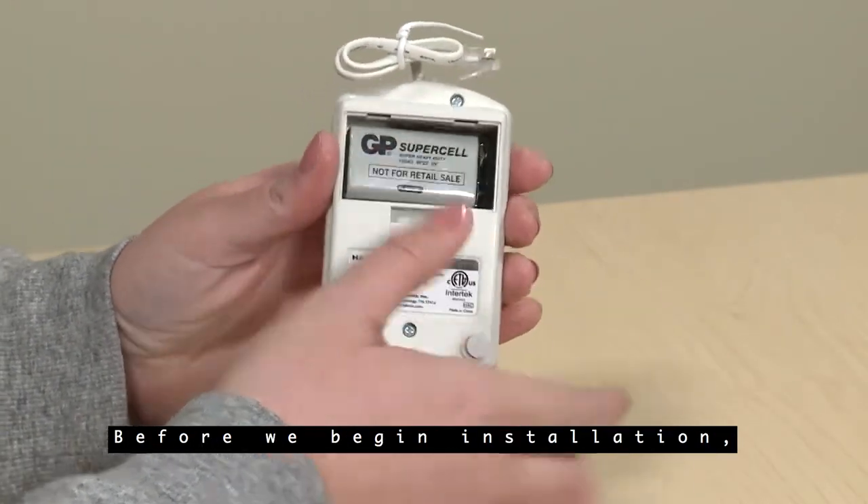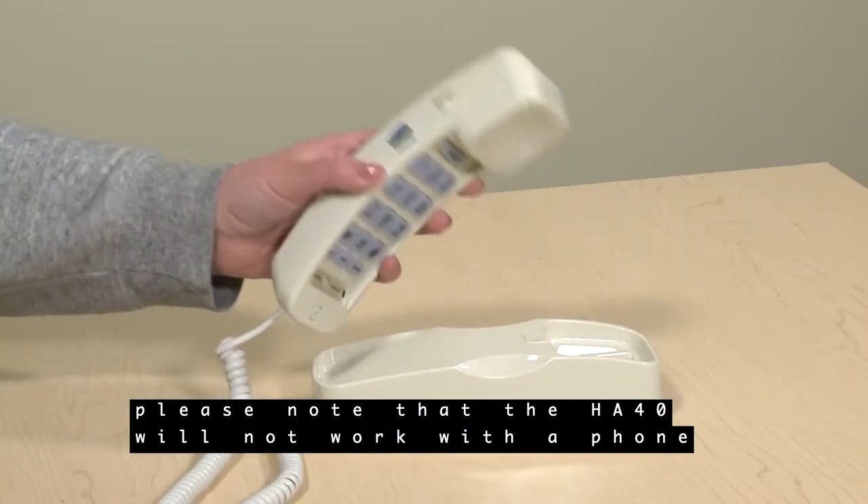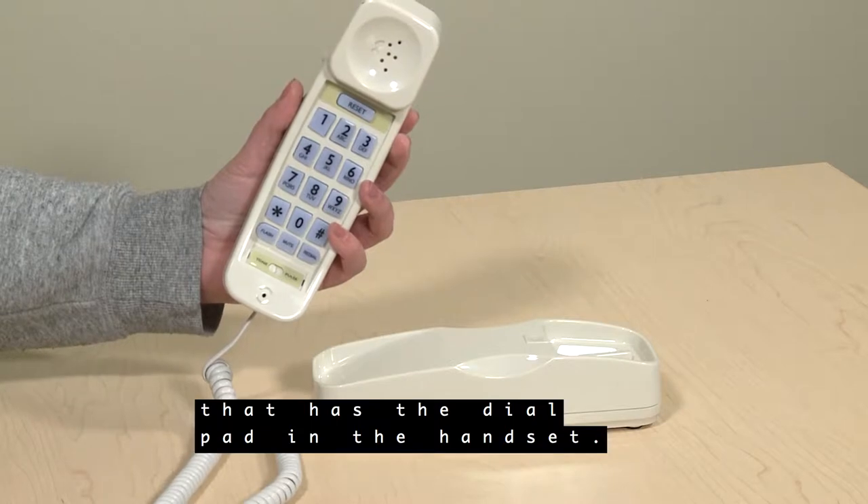Before we begin installation, please note that the HA40 will not work with a phone that has the dial pad in the handset.